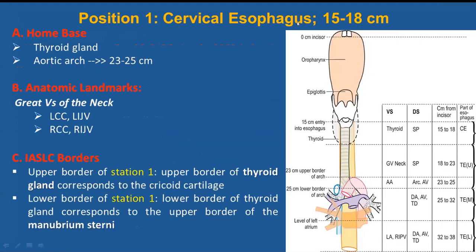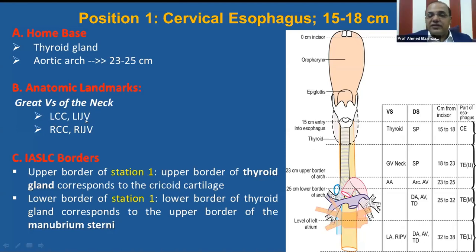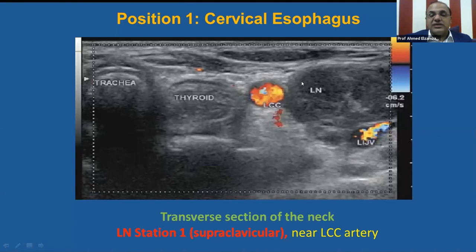Position 1 is at the cervical esophagus, 15 to 18 centimeters. The anatomical field includes the great vessels of the neck: left common carotid, left internal jugular vein, right common carotid, and right internal jugular vein. This image shows a transverse section of the neck with the trachea and the esophagus behind it. This is the left lobe of thyroid gland, left common carotid artery, left internal jugular vein, and the lymph node close to the left common carotid artery — this is lymph node station 1, the supraclavicular lymph node.